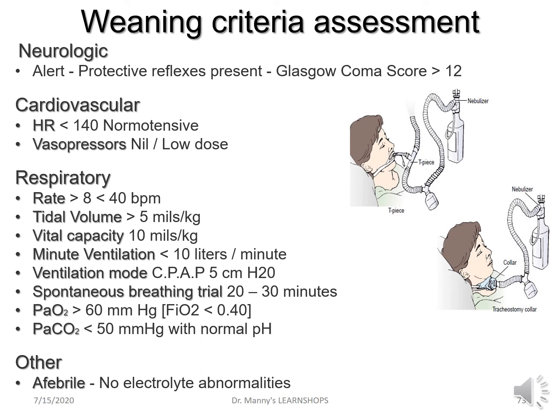So weaning criteria as a general rule, neurologically, they should be alert, have protective reflexes such as gag, cough and swallow, and have a Glasgow Coma score that is essentially greater than 12. Cardiovascular, they shouldn't be tachycardic, they should be normotensive.